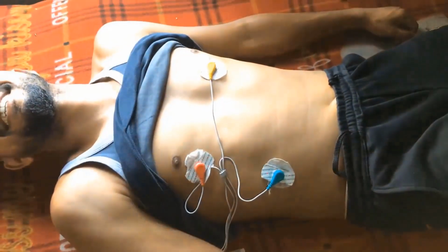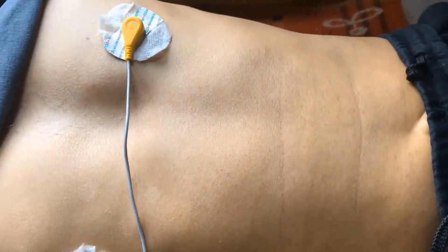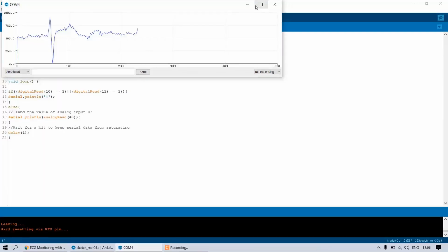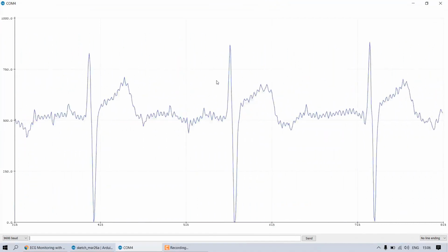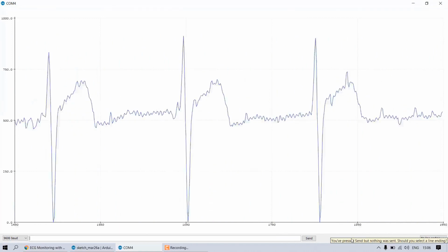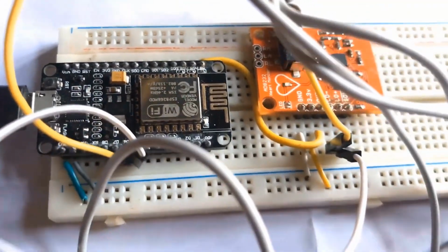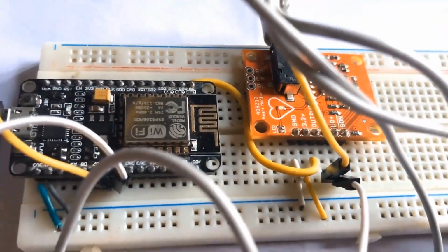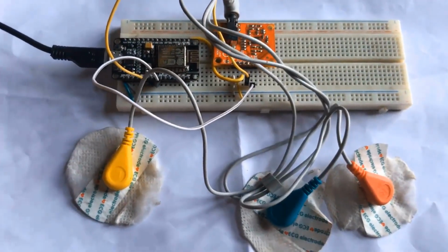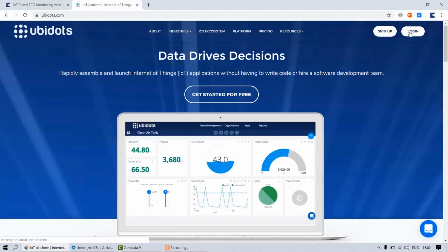In this episode, we'll learn how to make an IoT-based ECG monitoring system using the AD8232 ECG Sensor and NodeMCU ESP8266 12E Board. We'll simply interface the AD8232 ECG Sensor with the NodeMCU Board and connect it to the internet. We'll connect this lead to the patient's body and we'll monitor the ECG.